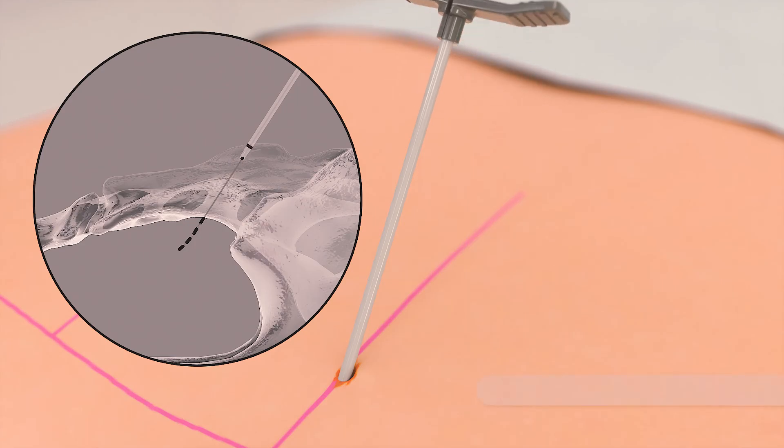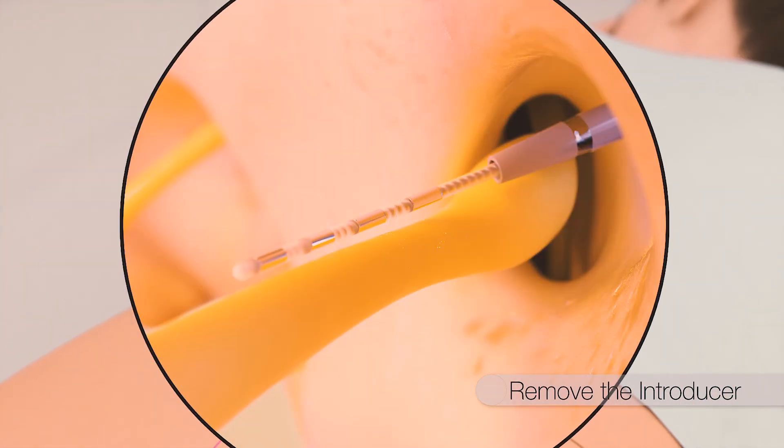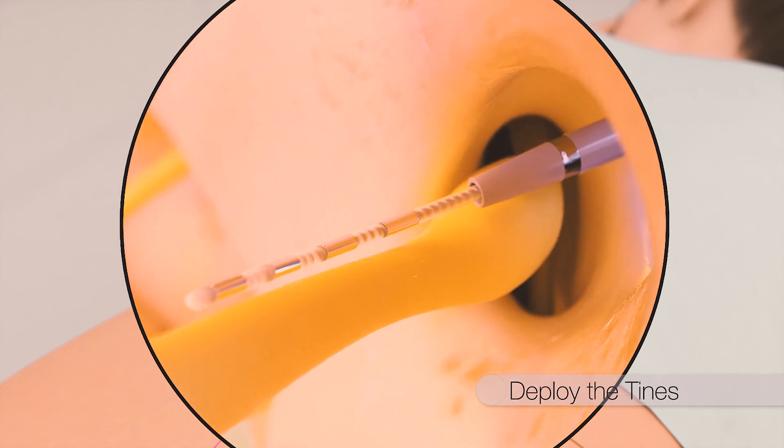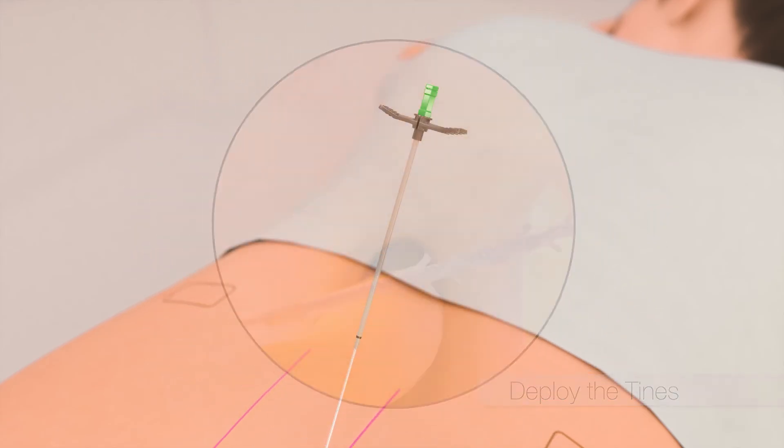Under live fluoroscopy, the introducer is removed over the tined lead, maintaining lead position and deploying the tines. The tines of the lead are arranged in a helical pattern, which results in smooth feeling deployment when removing the sheath over them. The stylet is removed along with the introducer sheath.